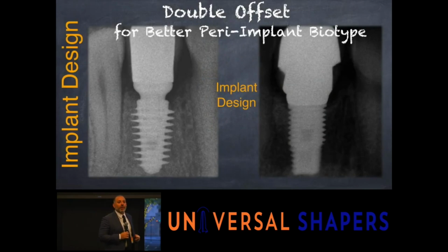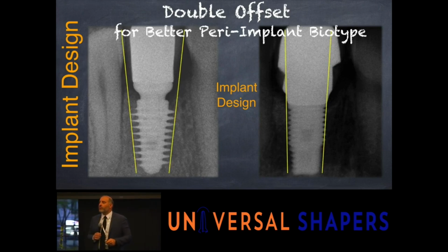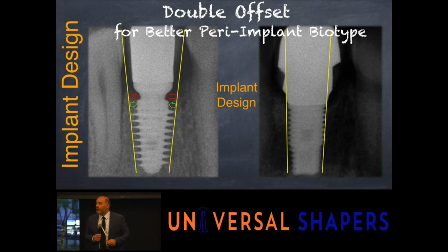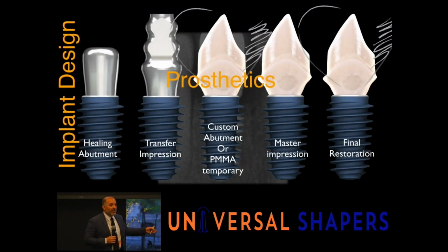Looking again at the two designs, from having a more tapered, bone preserved, soft tissue preserved design versus a straighter type of design, we preserve much more of the peri-implant bone and the peri-implant soft tissues, as opposed to the other implant on the other side of the screen. You just don't see that. And it should carry through from the healing phase.